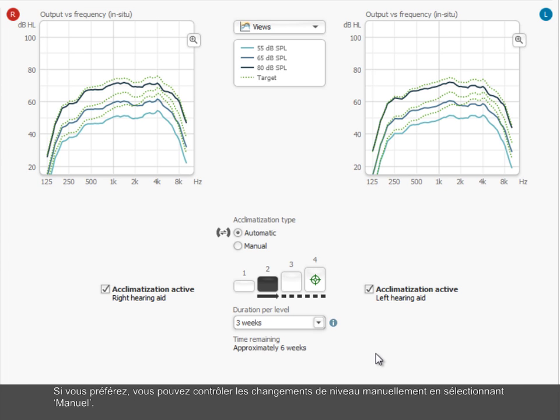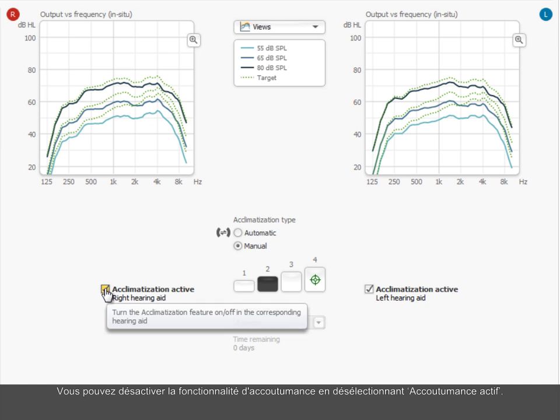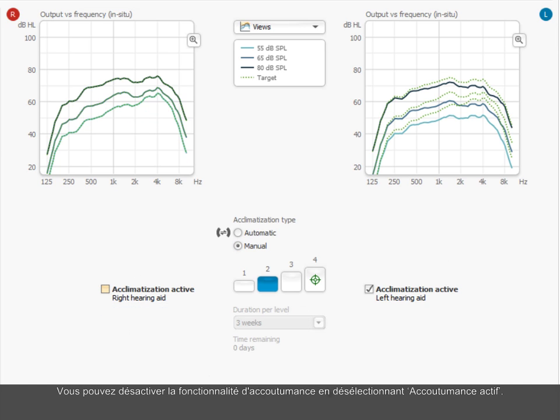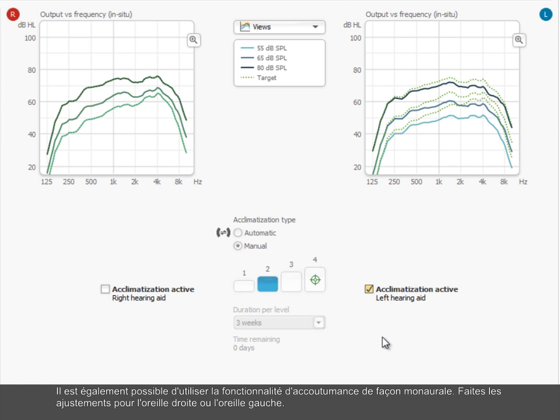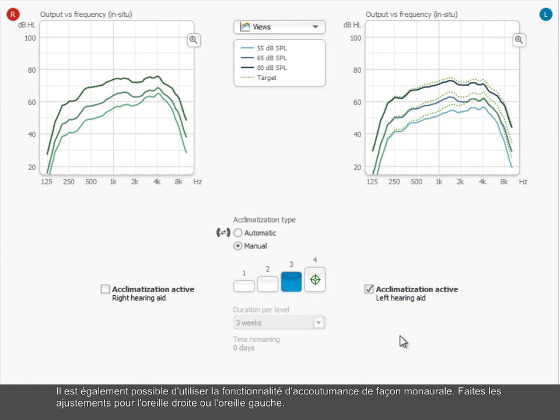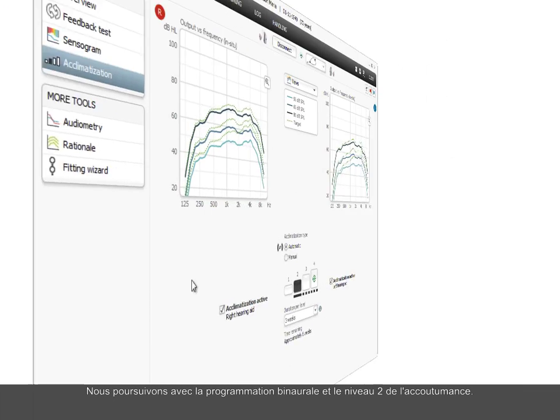If you prefer, you can control the level changes manually by selecting Manual. You can deactivate the acclimatization feature by deselecting Acclimatization Active. It is also possible to use the acclimatization feature monorally. Make the adjustments for the right or left ear. We continue with the binaural fitting and with acclimatization level 2.